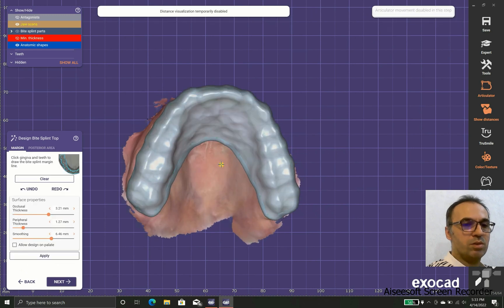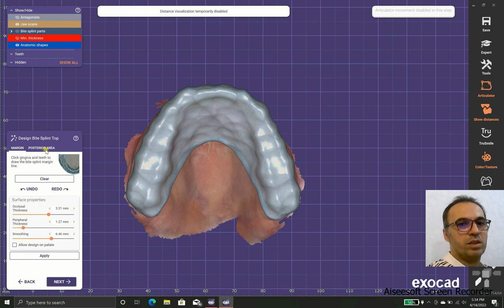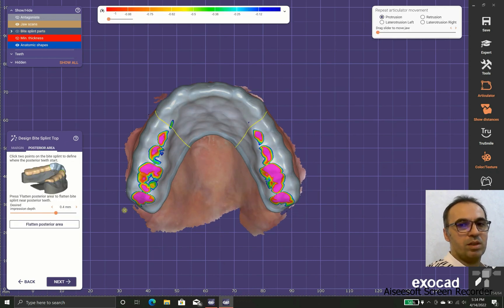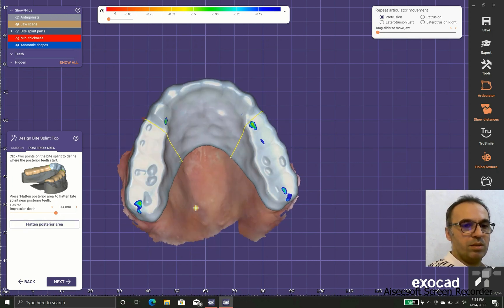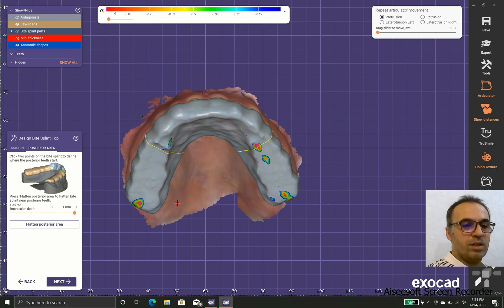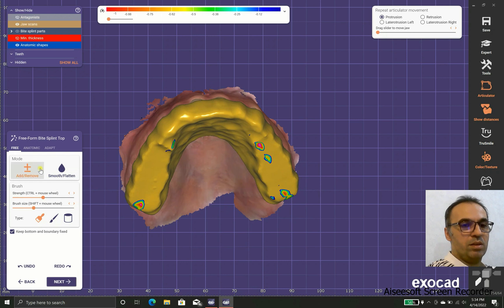This gives us good disclusion. We have one more option: using the posterior area in a flat way. As you can see, it flattens the posterior area, which is favorable because when it is flat we don't have any interference with occlusion.